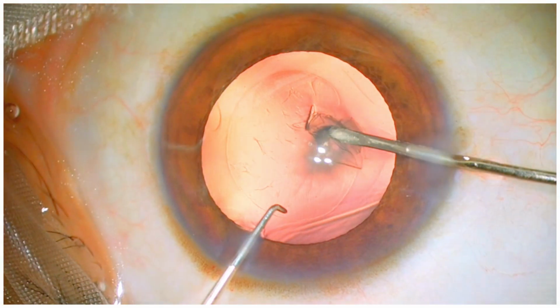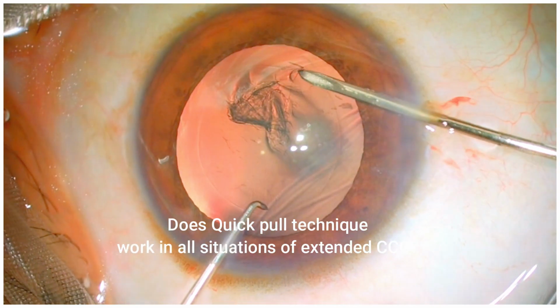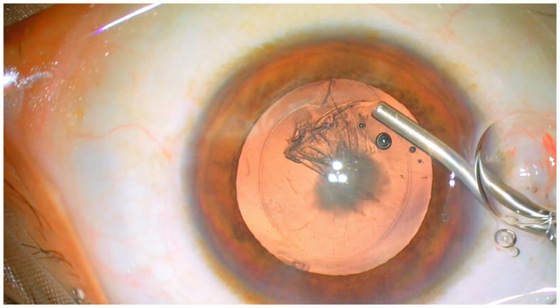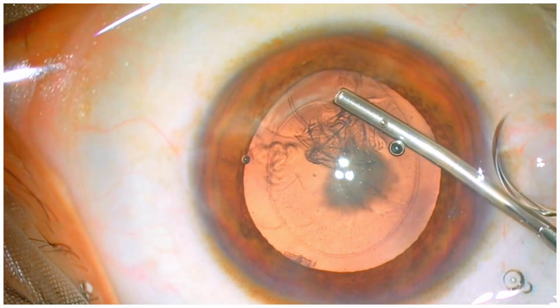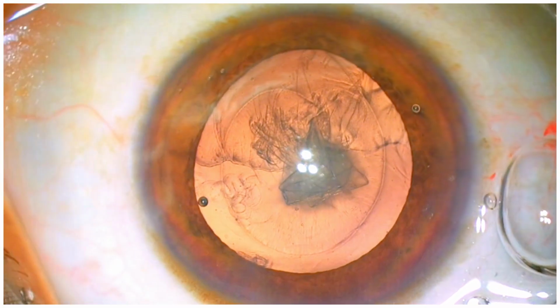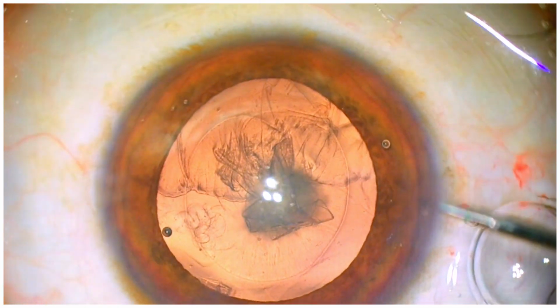Of course, there are situations where the quick pull technique will not work or should not be tried. Of course, do not use this technique if the zonules are very weak. In this case, the capsulorhexis extended because of shallowing of the anterior chamber. Now the surgeon is using heavy OVD to make sure that the anterior chamber is optimally filled and not overfilled. Now the surgeon is going to try quick pull, but watch here.